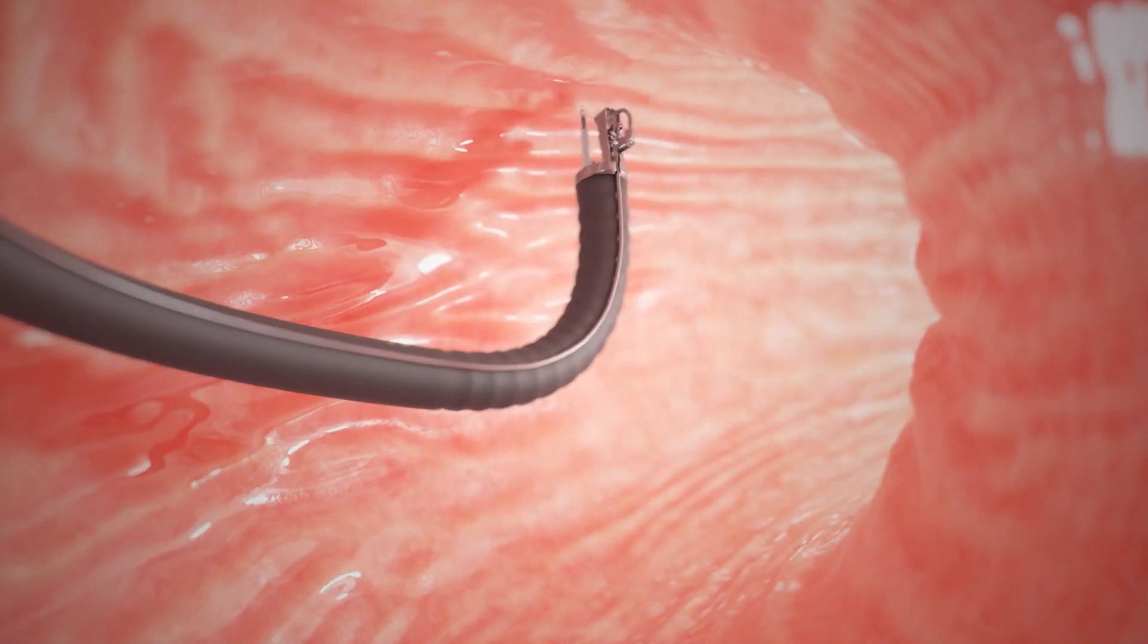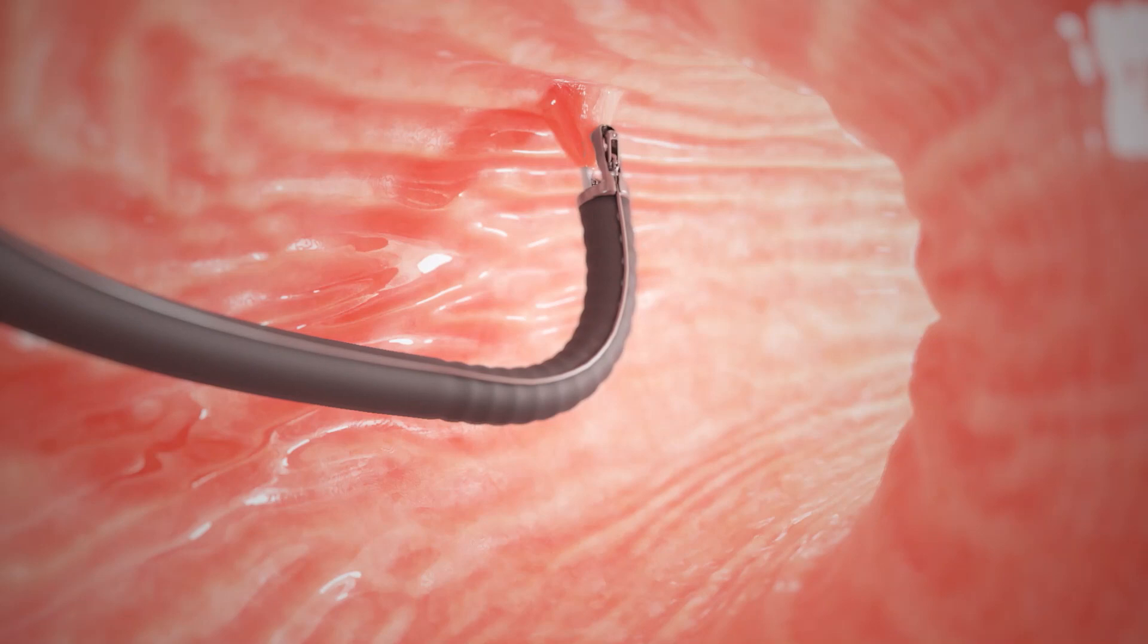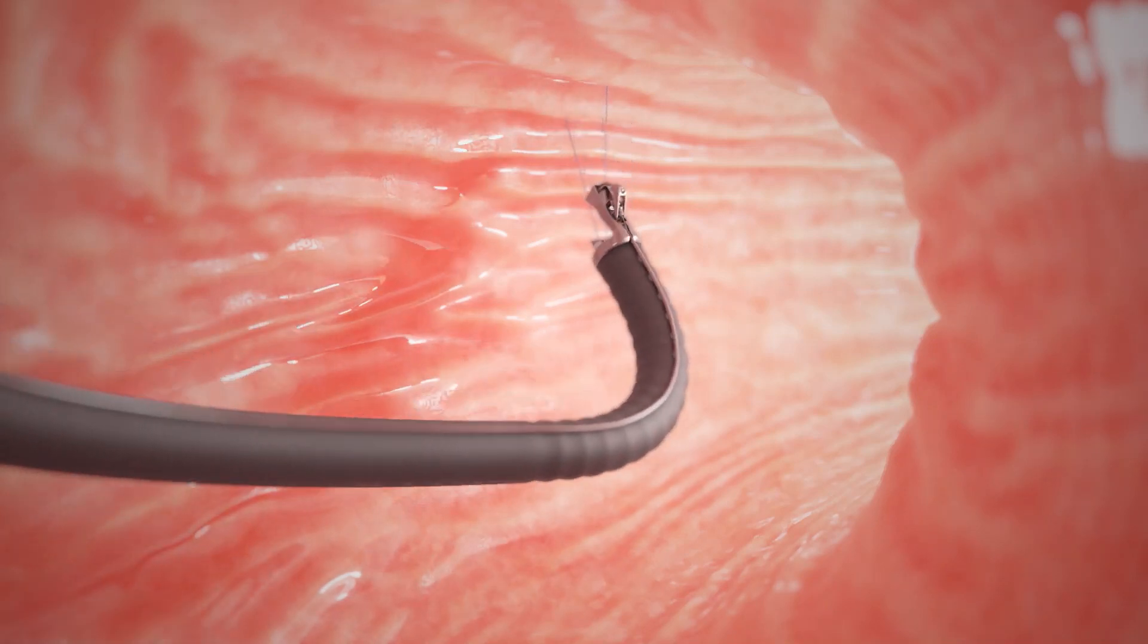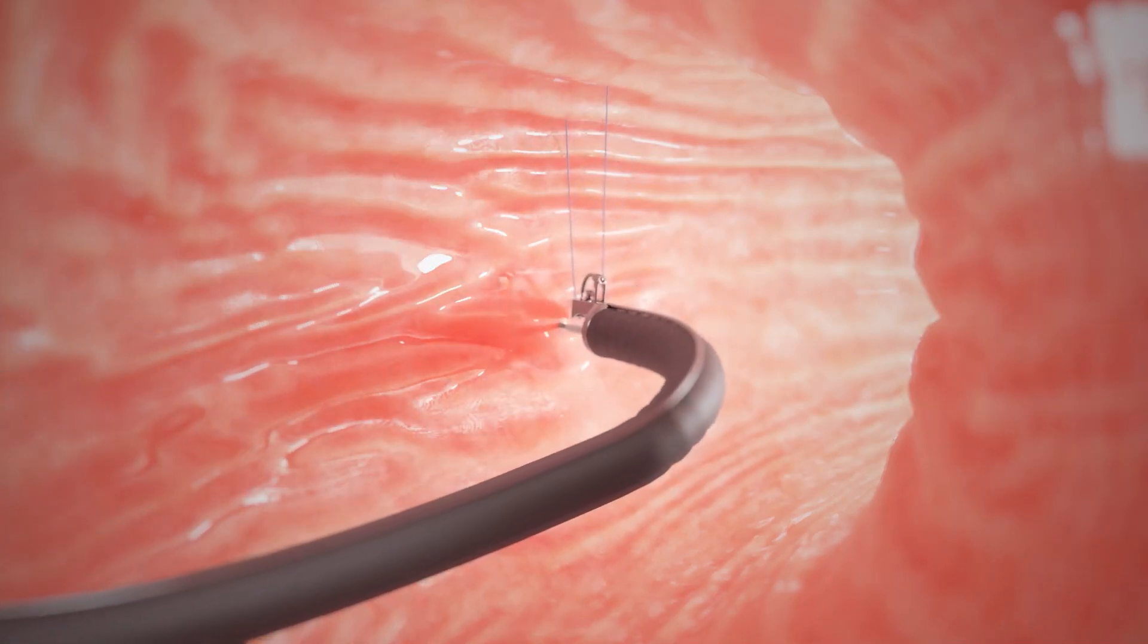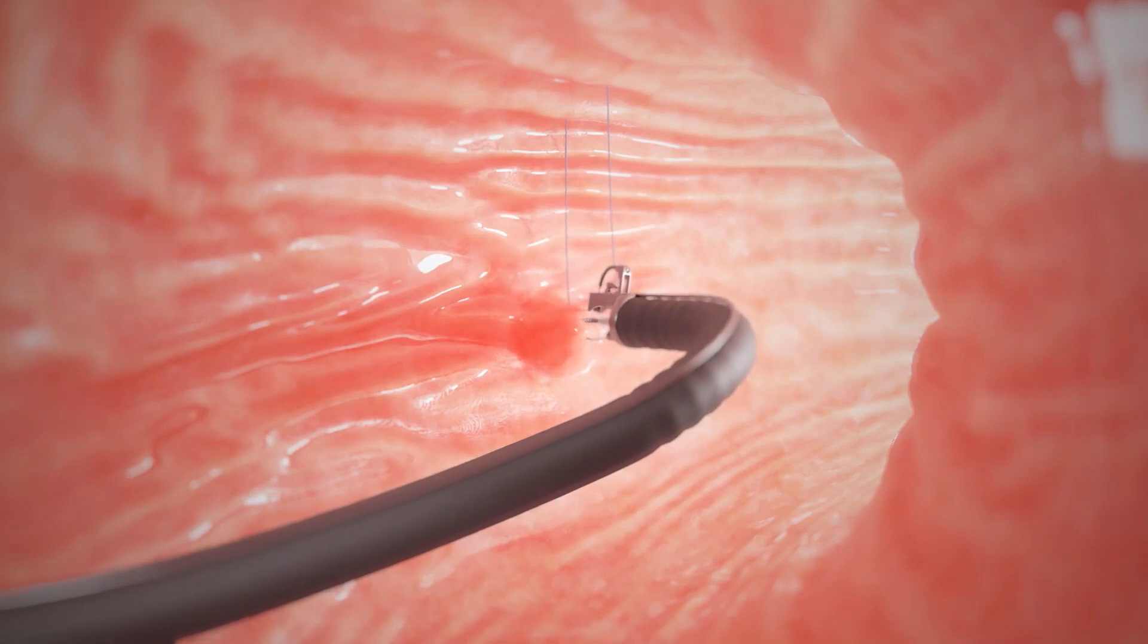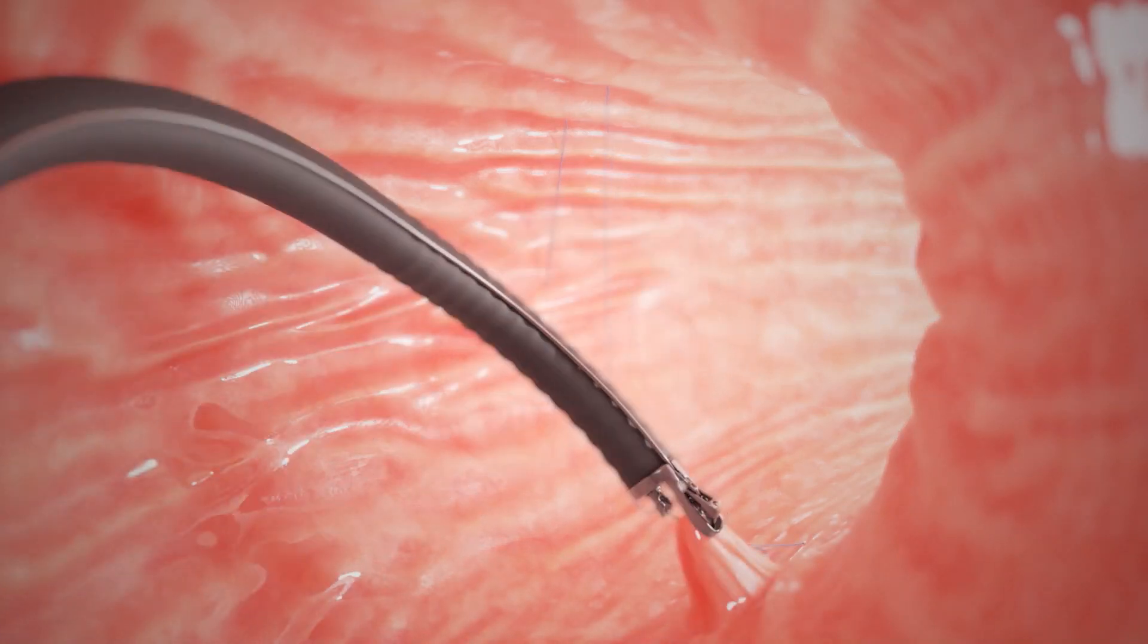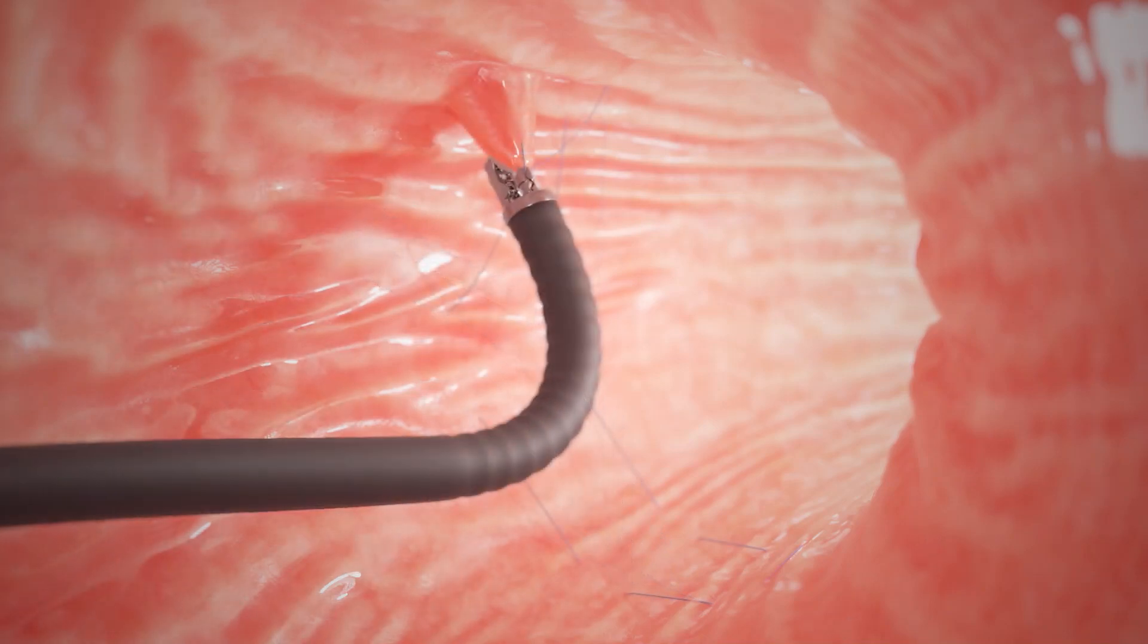The doctor uses the suturing device along the large curve of your stomach to sew it into a smaller shape. The stitches, also known as anchor sutures, are placed in a U-shaped pattern starting near the bottom of your stomach and working towards the top of the stomach.